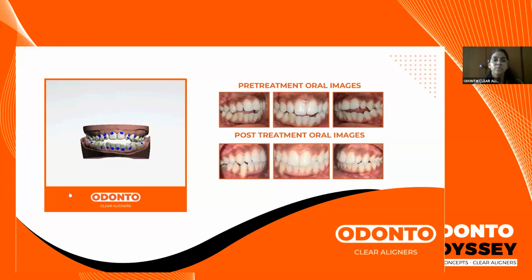So how do we proceed with this case? We will show you the video for this, and this video will take you sequentially through every step. You will see that there are multiple stages. It shows the amount of change that takes place with every aligner and how it will progress to the finish.